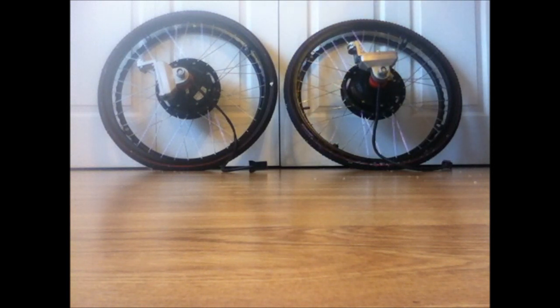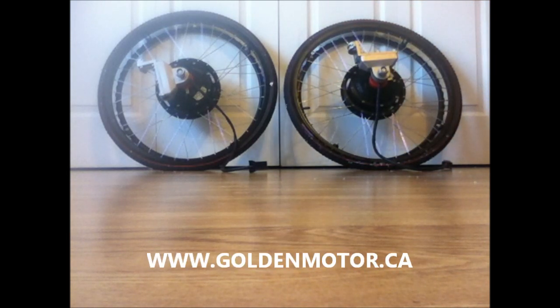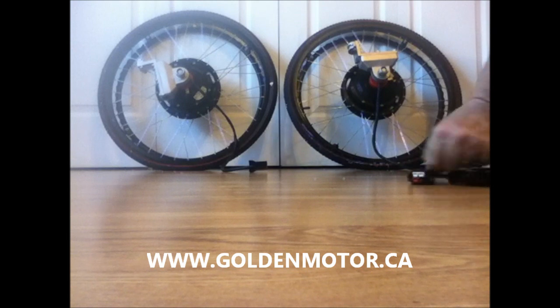One thing about these is the setup is so simple it's almost beyond belief. Maybe that's why Golden Motor doesn't provide a lot of documentation. Anyway, these are marked clearly.